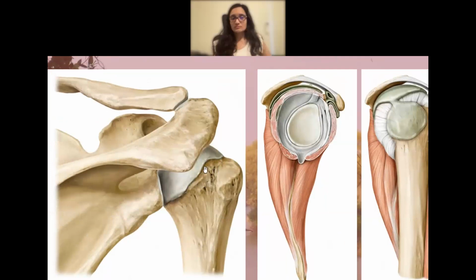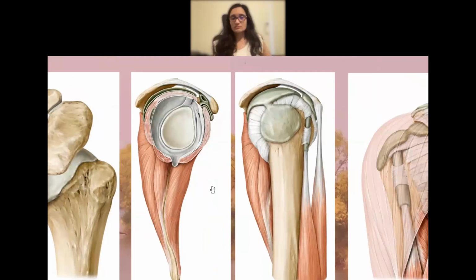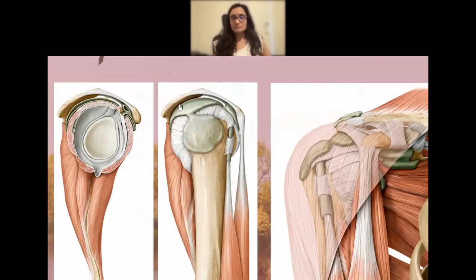Posteriorly, we have one important area called the bare area. This is the articular cartilage lining the humeral head, and we can see the trifaceted greater tuberosity. This is the middle facet and this is the inferior facet, wherein the middle facet is going to be the footprint of the infraspinatus. Just medial to that, we will see some pitting; even in normal patients, sometimes we can see some pseudo-erosion-like appearance. That is what the bare area is. When we approach from posteriorly, we can safely land at this place, which is also intracapsular and intrasynovial, or we can even go into the joint cavity as we see in the subsequent examples.